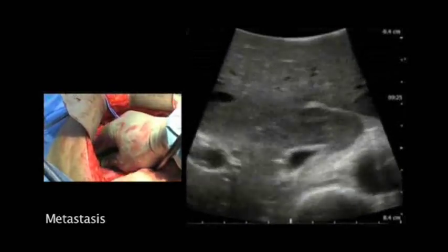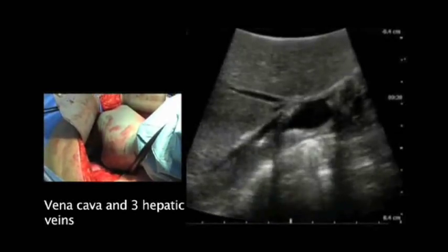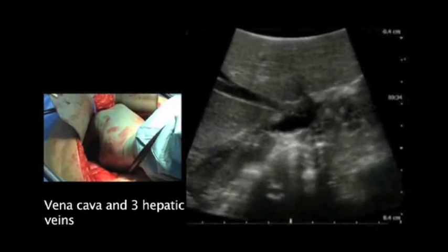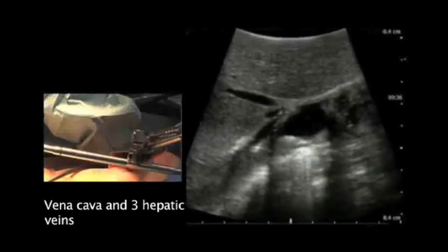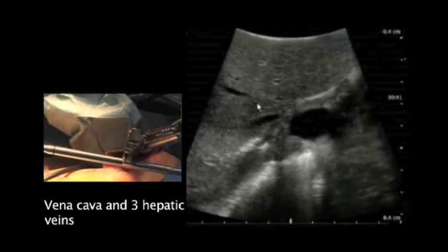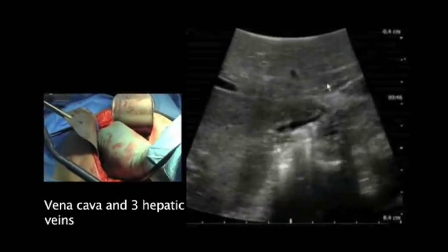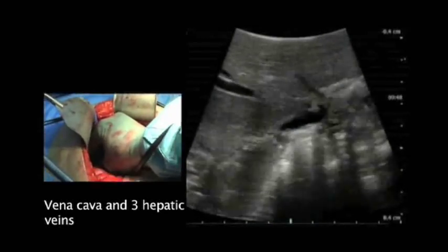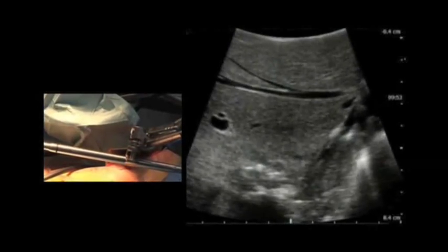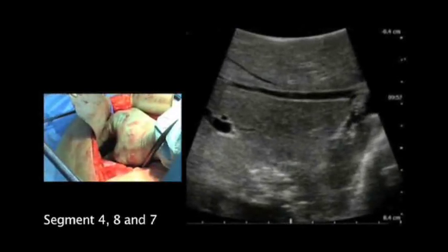At this stage we have to search for the vena cava and the more superior part of it here, where you can see the junction of the three liver veins into the cava. We have the medial liver vein here, the right liver vein branching here, and then the left liver vein leaving to the left. We are very interested in this segmentation because we will have segment number four in front of this medial liver vein.